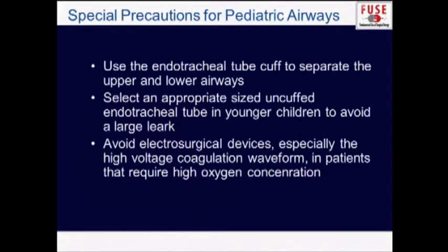So another issue for pediatric patients is that the small diameter airways in infants and children are at particularly high risk for operative fires. Again, as we heard earlier today, you're combining combustible materials and an oxygen-rich environment in a very limited space. So there's several precautions that you can take to reduce the risk of fires, and I think, again, when you're dealing with these patients, you want to have that little powwow before. This is a high-risk situation. Talk about what you can do to prevent a fire.